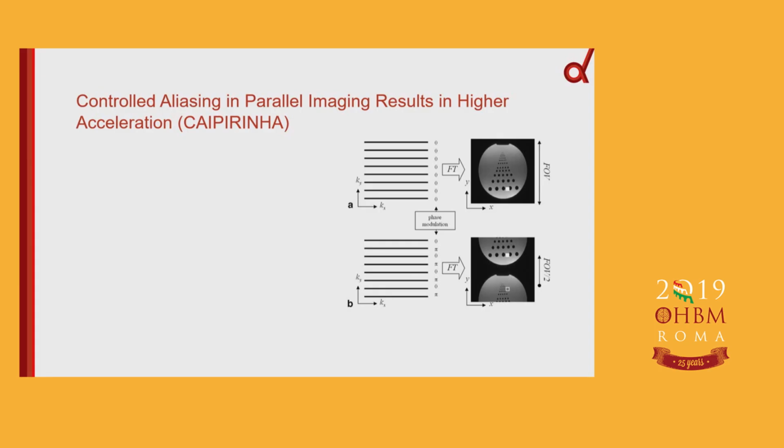Because according to the Fourier shift theorem, if you have 2 slices which are close to each other and you want to disentangle them, if you could magically shift one of them by half a field of view, you'd be having a much easier time in terms of the coil sensitivities of doing that, right? So just by adding a phase gradient, for example, alternating the phase of lines in k-space in one slice but not the other, that will shift it, and your whole problem of disentangling becomes much easier.